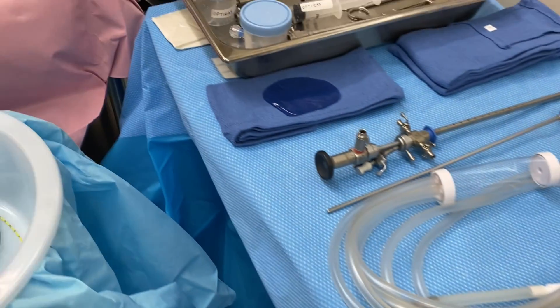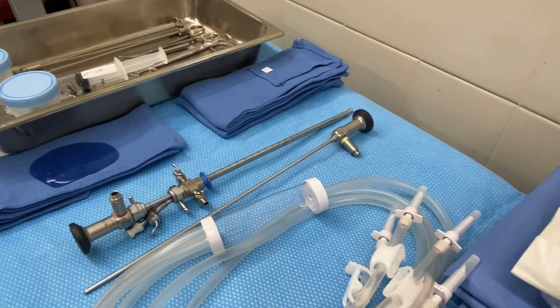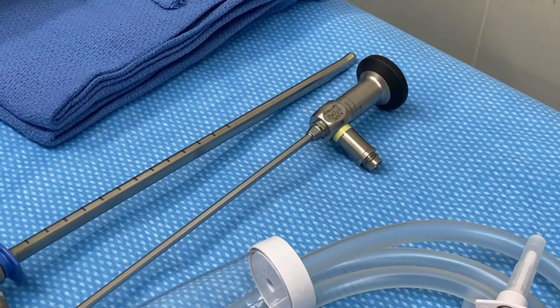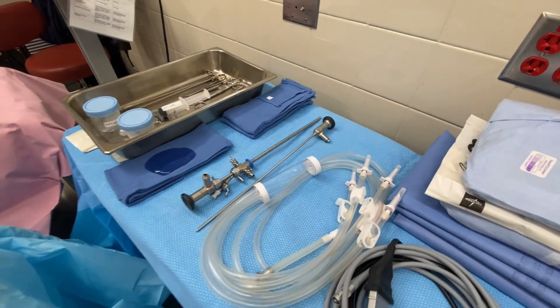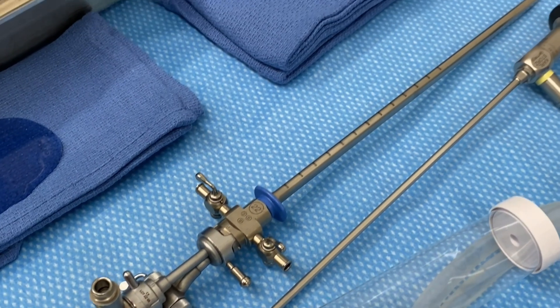Here we have two scopes: that one is a 30-degree scope and that one is a 70-degree scope. I have our 30-degree scope in a sheath right there.